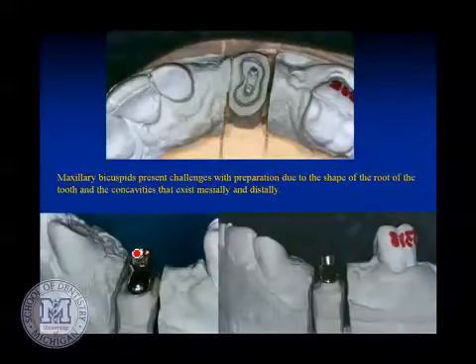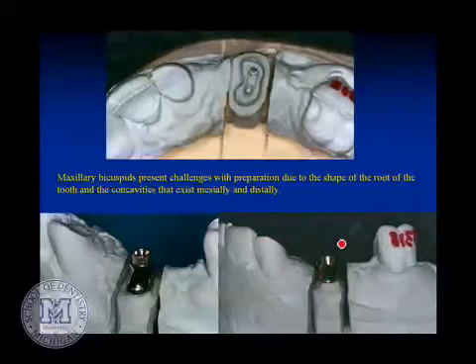Okay? But can you picture this if this were the distal abutment of a 3-unit fixed partial denture? So let's say you had a full crown on the cuspid, a pontic here, and this was your crown on the second bicuspid. Can people see that you might have a plaque trap right there? And when you're following this patient after your fixed partial denture is done, of course this guy's going to get a floss threader in there 3 times a day and wear his fluoride tray every night for at least an hour, right?